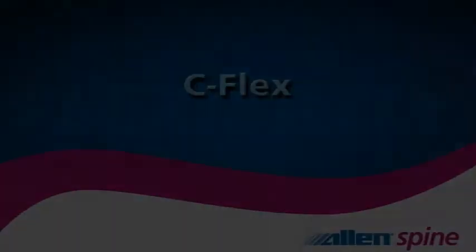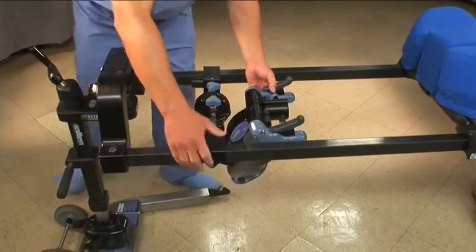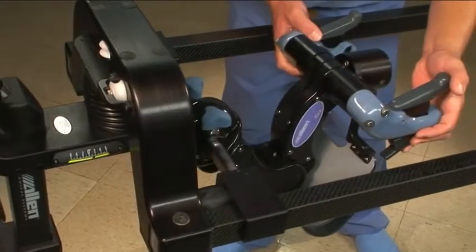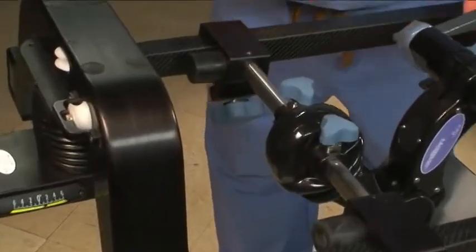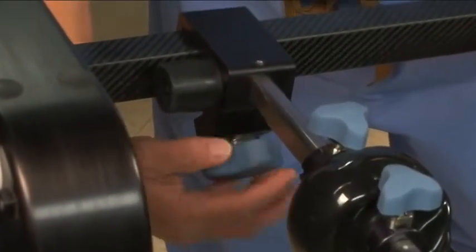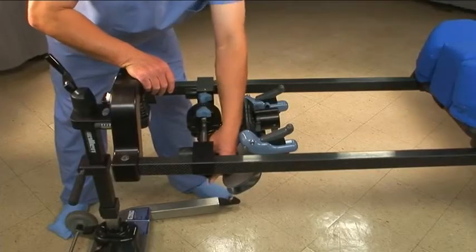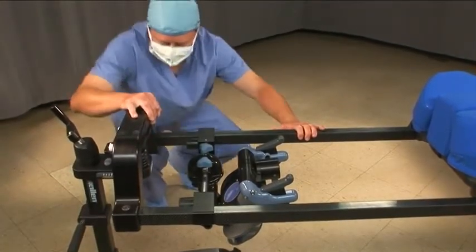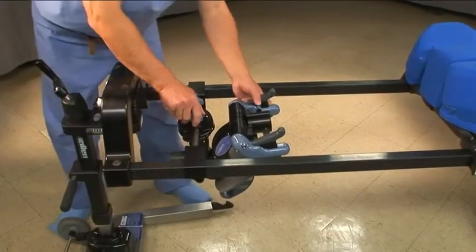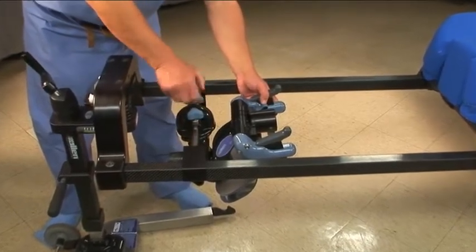The C-flex is intended as a universal head positioning system. The C-flex is oriented with the bumpers toward the head of the frame. The bumpers ensure that enough space is left for full adjustment of the C-flex. Fully tighten the blue knobs on the frame mounts. After tightening the knobs, check that the mounts are fully seated and flush on the frame. The C-flex can be moved laterally by loosening the upward-facing blue knobs.